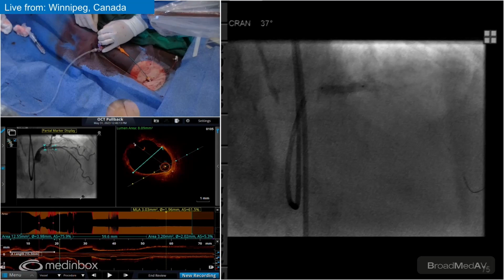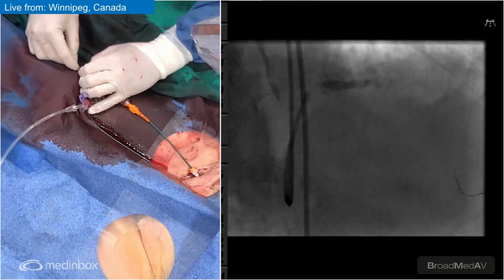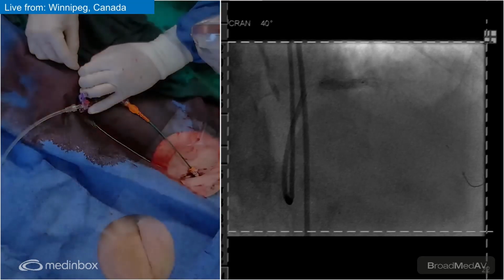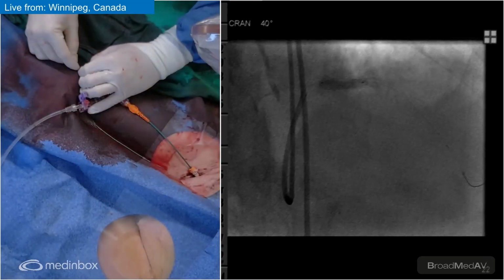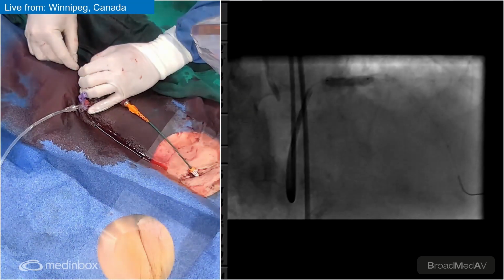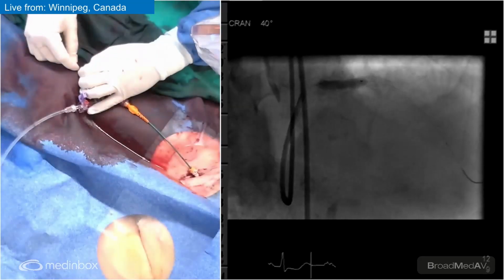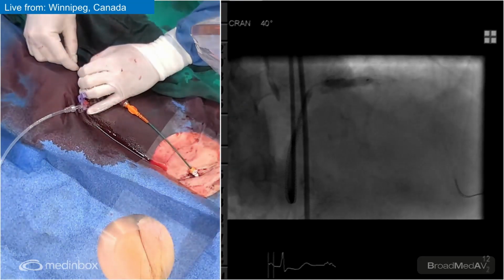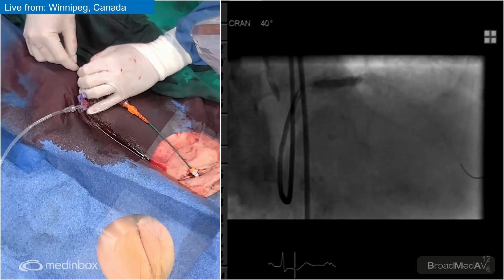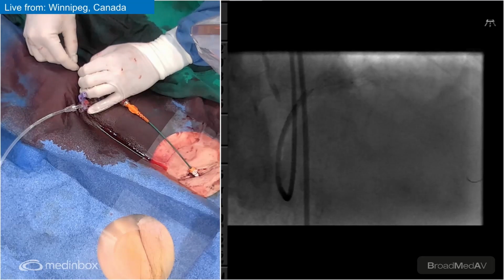Let's stay up for 30 seconds. Make sure we take a shot at that with Cine potentially. Yes. Okay, let's do a Cine here. I think it looks fairly good. Much better than it could have. And down. I think that 14, 2 over made a difference. Absolutely. Although I'm always apprehensive about using a large burr. Nodules or large burrs.